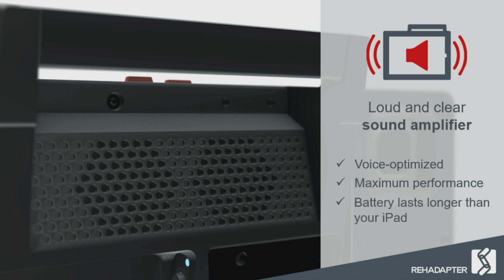As you know, battery life plays an important role for the usage of the device, and we have achieved a permanent battery time of about 12 hours of permanent use of the voice of the Rehadapter, to be able to use the device over a regular day.